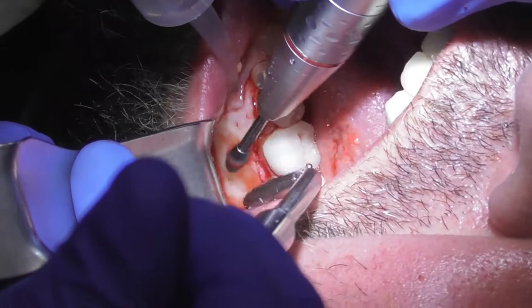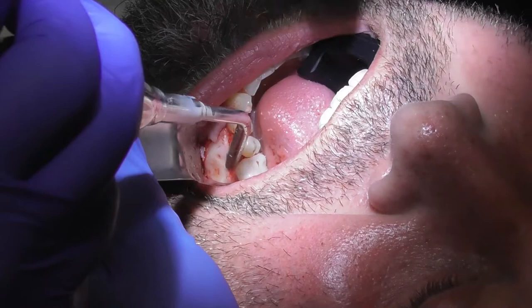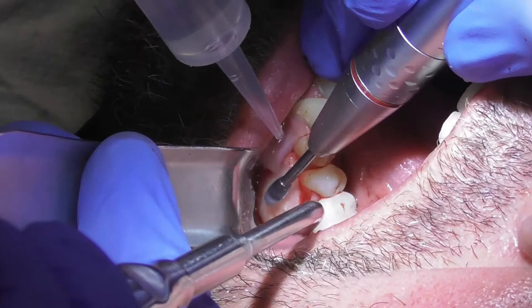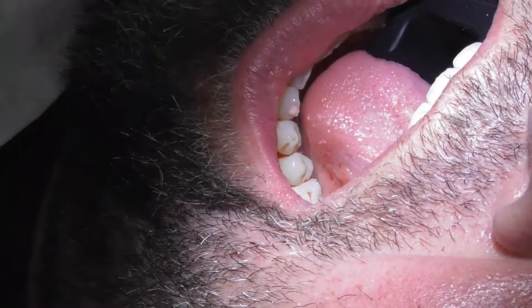I slow down the RPMs a little bit on the handpiece, which means you feel the vibrations more — that's what that is. Every now and then the assistant touches my handpiece with the suction, which is unavoidable, and it makes a clicking noise. It's just part of keeping things dry so I can see, while she lubricates it and squirts water to cool the burr.